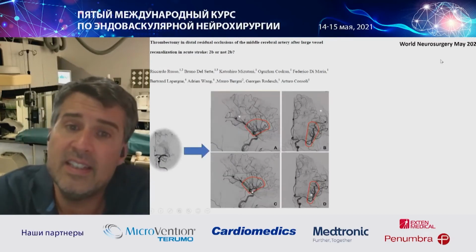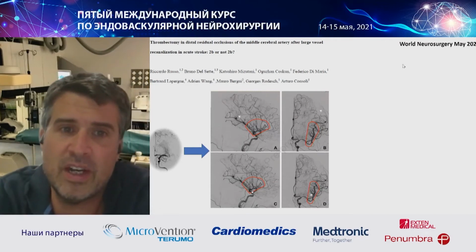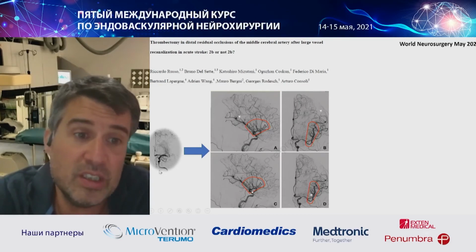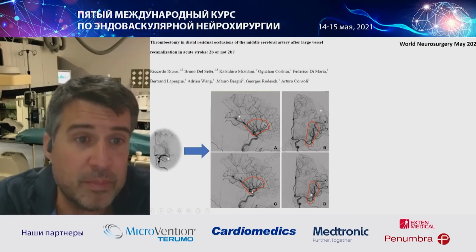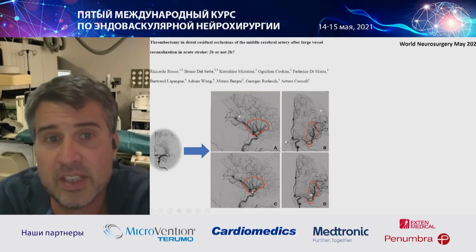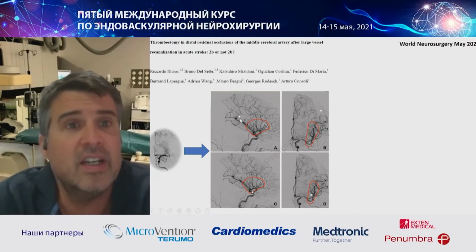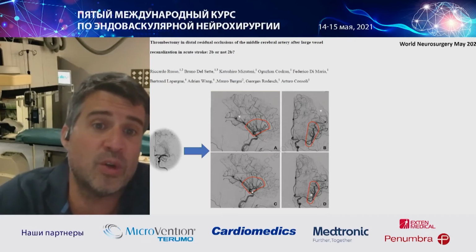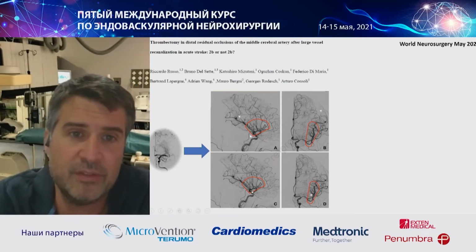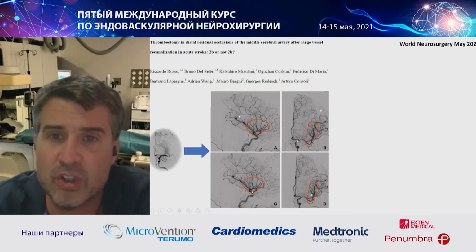That's another very recent study from this month. In this study, they are addressing a different scenario. Now we're not talking about distal occlusions from the beginning, but about patients that arrive with a proximal occlusion, and during the procedure, there is a substantial recanalization, but not complete recanalization. And now there is what they call a residual distal occlusion after initial thrombectomy. What should we do in this case? After we did a thrombectomy, should we chase these distal clots or not?